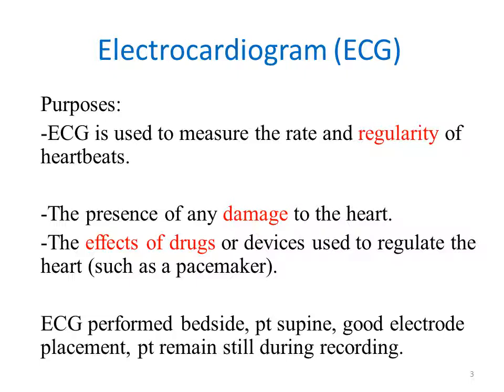The effect of drugs or devices used to regulate the heart such as a pacemaker. إذن تأثير بعض الأدوية أو زراعة منظم لكهربائية القلب. تأثير هذه الأشياء على كهربائية القلب could be detected by ECG.